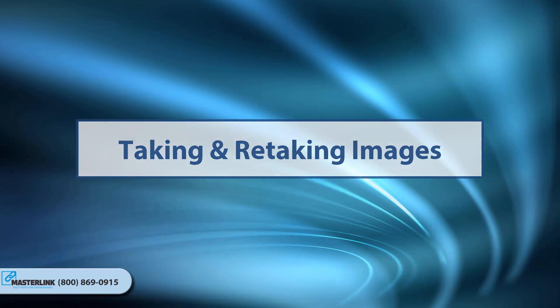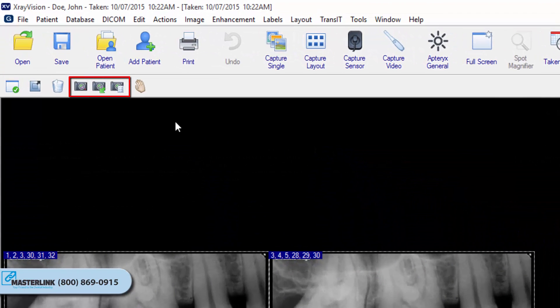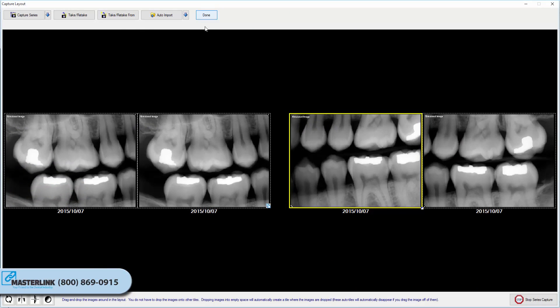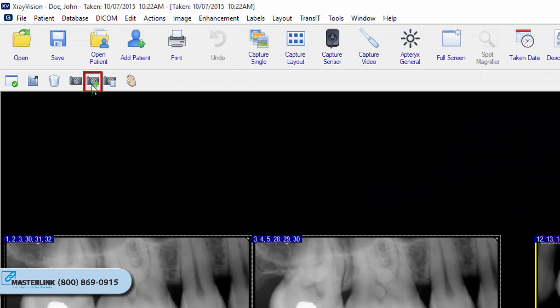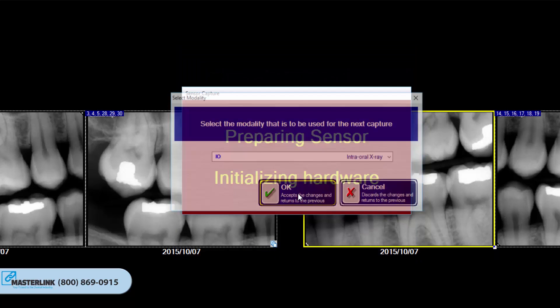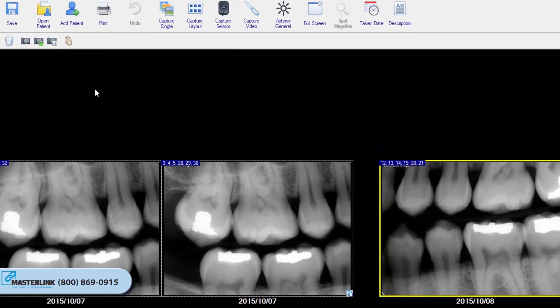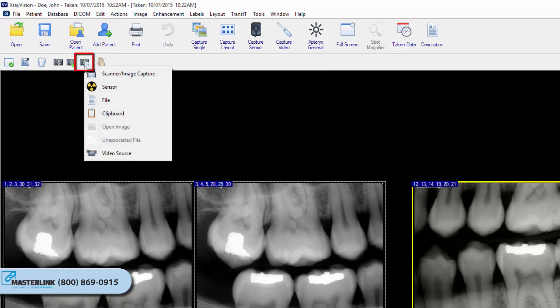Taking and retaking images. When a tile is selected in a layout, an image can be added using one of the three capture buttons in the layout view window. The Capture Layout Images button launches the capture layout window for image acquisition. The Take Retake Image button allows the user to take or retake an image from the standard hardware source used with the layout — for example, if the layout source is sensor, the appropriate sensor extension is used for capture. Note: the capture layout screen will not be launched; instead, the hardware interface will display ready for a single image capture and the image will return to the selected layout tile after acquisition. The Take Retake From button allows the user to take an image from a different hardware source than the one specified for the layout.